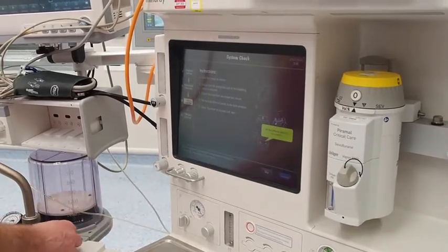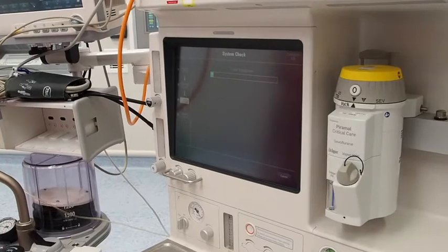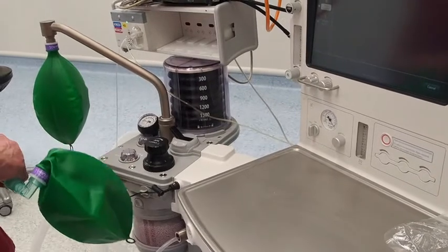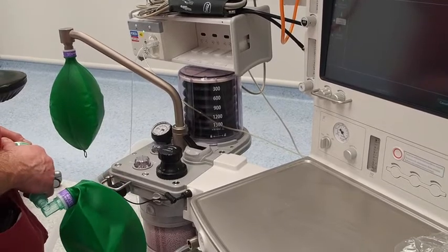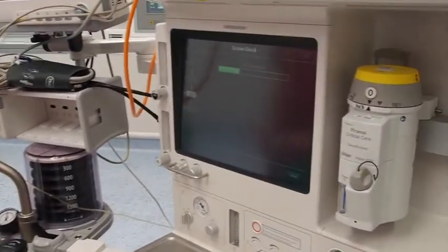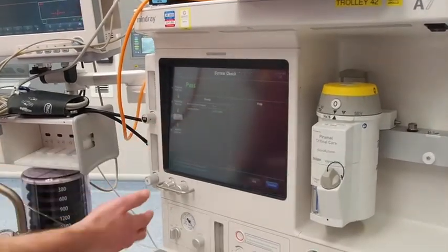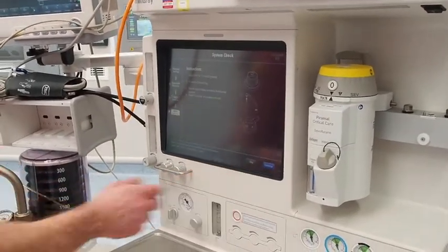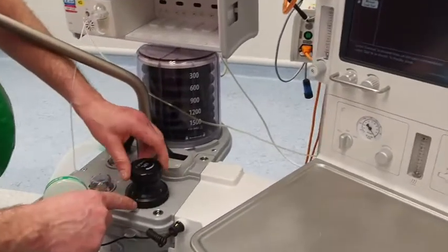And it says turn this to the auto position. It's quite idiot proof, which is why I can use it. Okay, this has come up as a pass. If it comes up with a fail, you're going to have to ask one of the anaesthetic assistants what to do about that. Continue again. And now, we turn the APL valve onto 50.